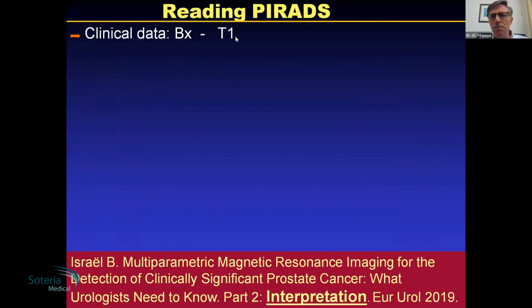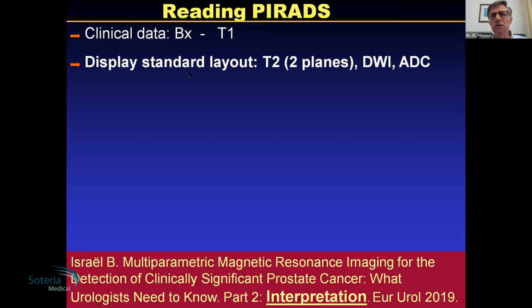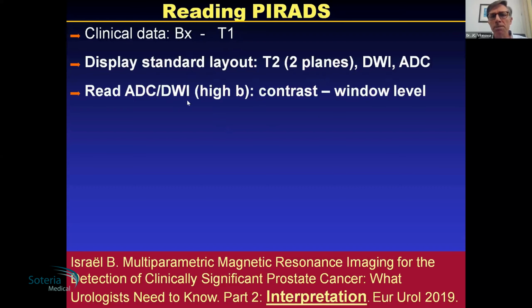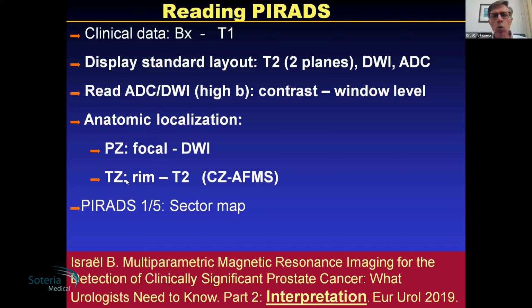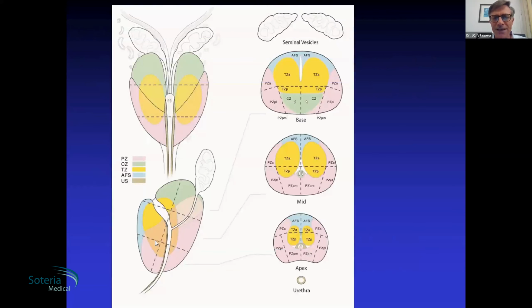Any patient who has had biopsy, we should read previous T1, because there might be hemorrhage, and it's going to interfere in my signal intensity, probably. So be aware, any patient after biopsy, we should read the T1 previous to any PIRADS reading. We should review on the same screen all the different sequences, T2, diffusion, and ADC. We should adjust properly. We should ensure that we have the image with a high b-value, and we have to localize the lesion and read where the lesion is in the peripheral zone, the diffusion, whether there is a lesion that might be focal, and find the rim whether we are with a nodule in the transition zone. The final decision is whether the patient might have high or low probability of prostate cancer. And then we have to localize from the segment of the template of the map of the PIRADS that we have to include in our report.